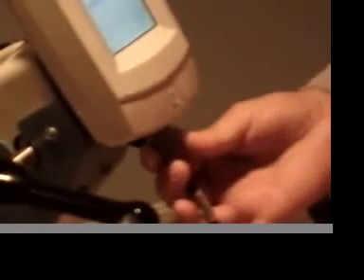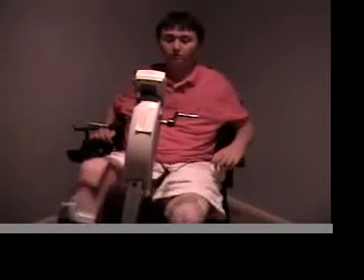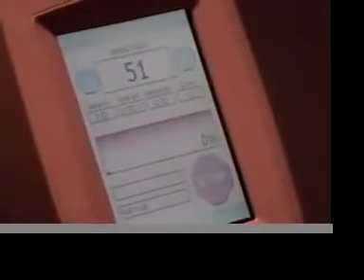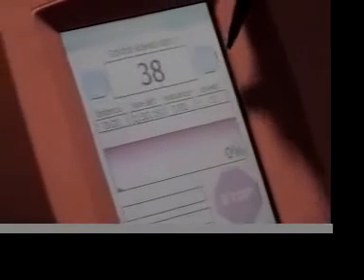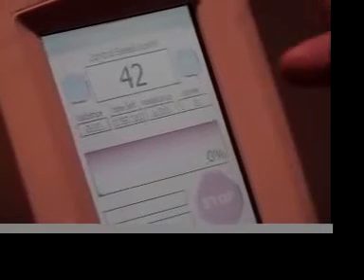This is how you start. You click the start button and then, after it warms up, first in a motor function which is called passive therapy. Then after about a minute it goes straight to active mode, which is electrical stimulation. Right there you are seeing the addition of speed, which is RPMs — I like it to be around 42 revolutions per minute.